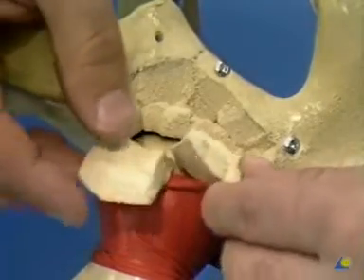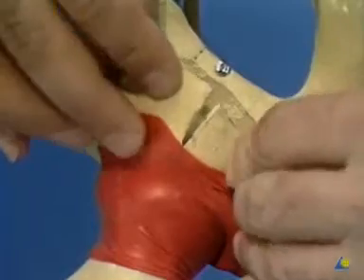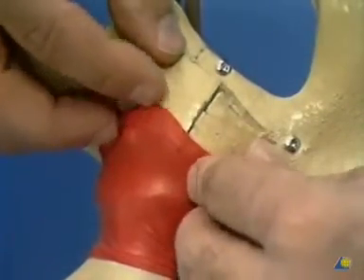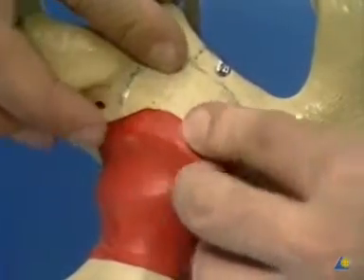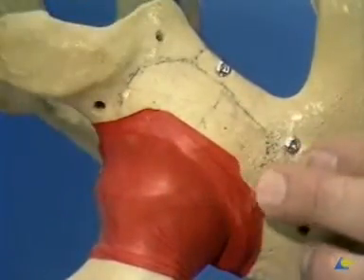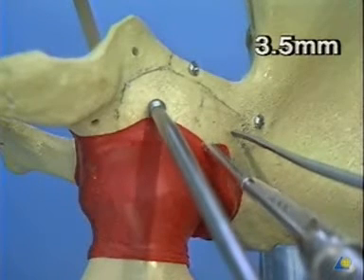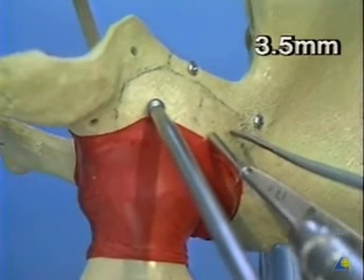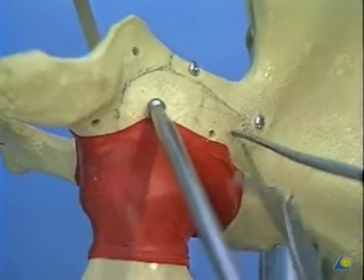The posterior wall fragments attached to the hip capsule are now reduced into position and held with the ball spike and at times a periosteal elevator. These fragments will be fixed in place with a 3.5 millimeter cortical lag screw. A 3.5 millimeter gliding hole is drilled into the fragment, followed by placement of the 2.5 millimeter threaded hole.